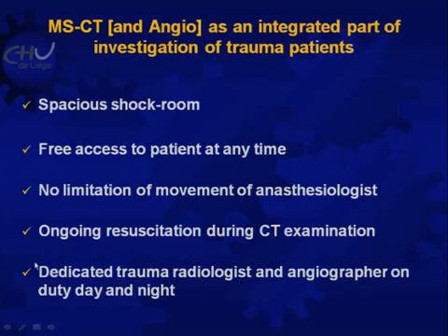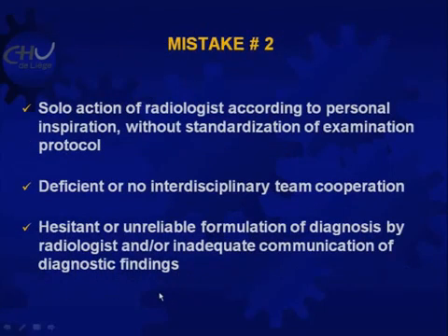Mistake number 2 would be a mistake of not organizing your rooms, but of organizing your activity. Trauma is a process which is going on in a standardized way. Trauma kills in a pre-set format, and the mechanism of trauma is always the same. Therefore, you need standardization. In all respects, the anesthesiologist has standardization, the trauma surgeon has standardization, and we as radiologists, we need standardization of our examination protocol.